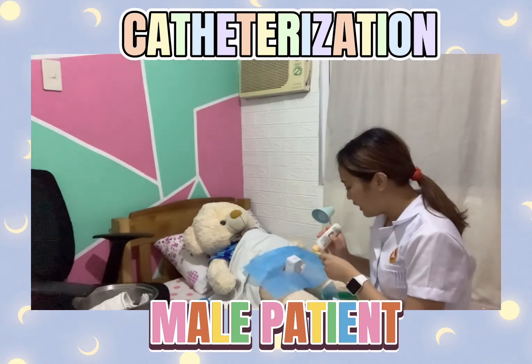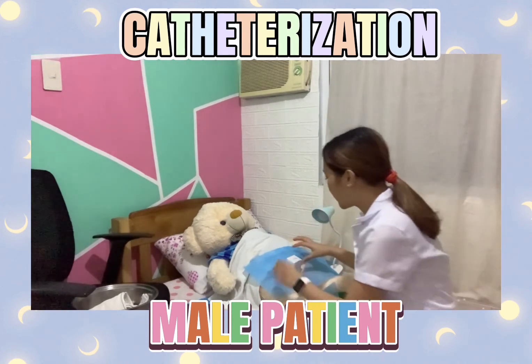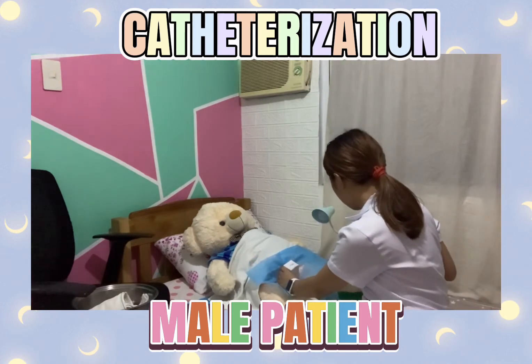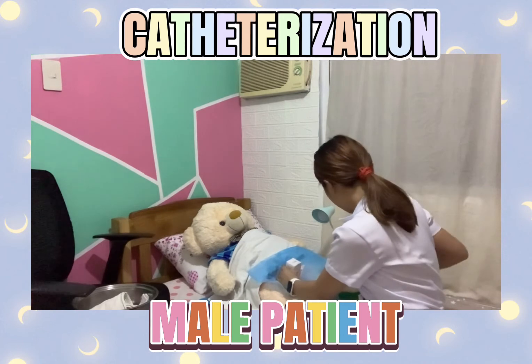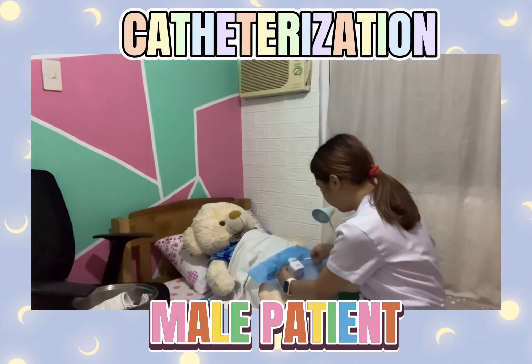And then, after lubricating it, we need to clean the penis of our patient. So, we will hold it, and then we will clean it. For uncircumcised patients, make sure to retract the skin and clean the penis. And then, dispose. Going to the glans penis. Then, dispose. And then, going to the base.